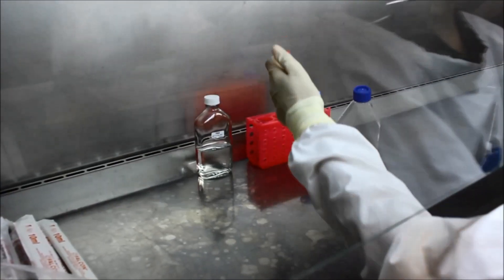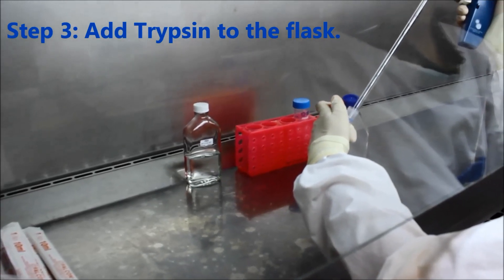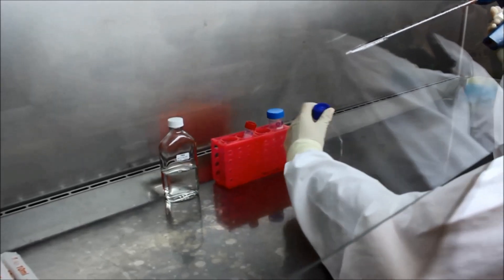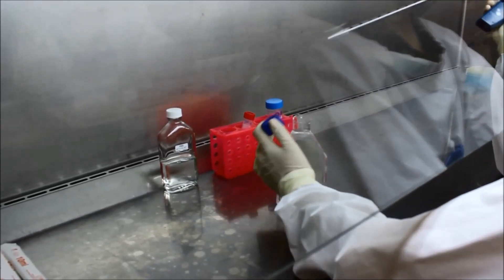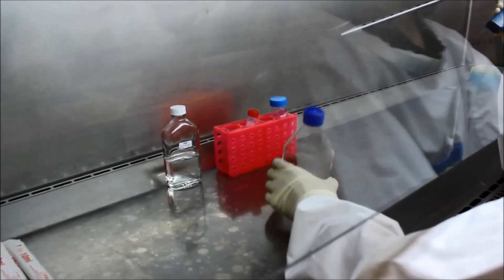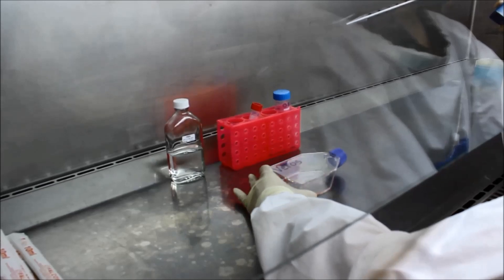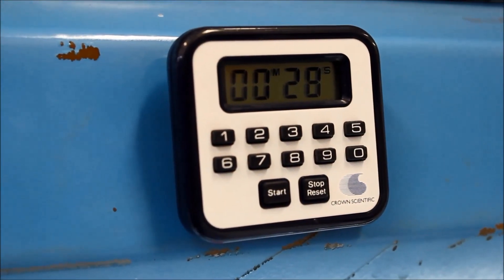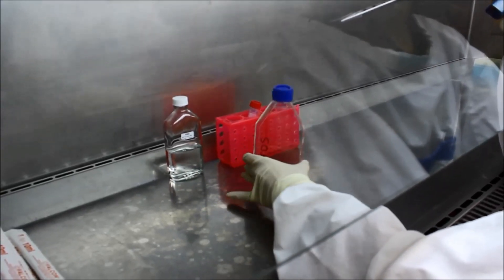Add five mils of PBS with trypsin and EDTA to the flask, and then leave flat for 30 seconds to allow the cells to absorb the trypsin. After 30 seconds, remove and discard the trypsin.